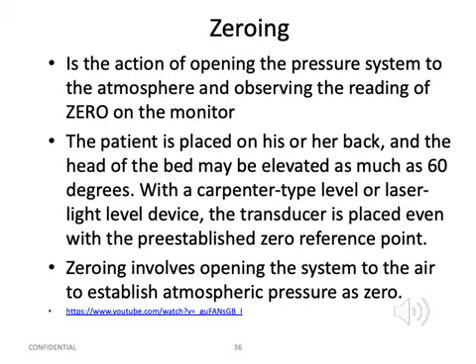هلا once we do that رح يطلع عندكم اللي هو الزيرو reading، وبنعمل fast flush بيطلع عنا later on اللي هو square wave اللي we've talked about it earlier, and then reading will be zeroing and then we make sure إنه إحنا we are taking reading from zero وعملنا زي ما قلنا zeroing للreadings.